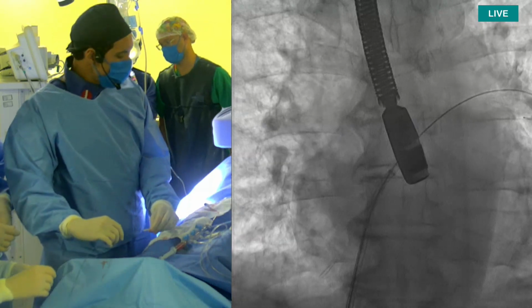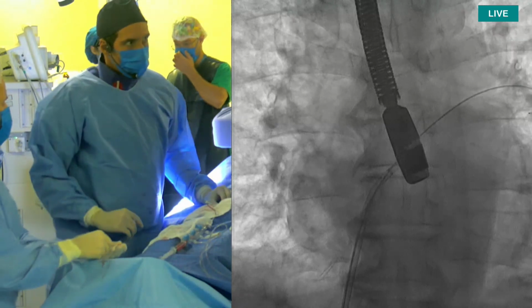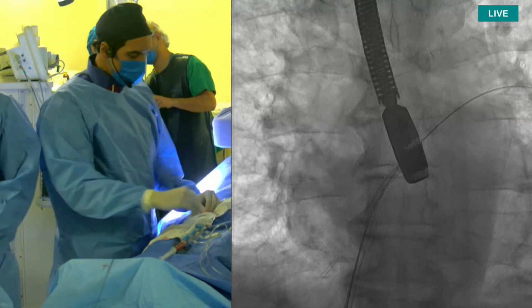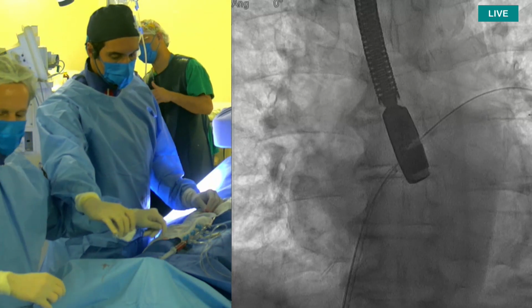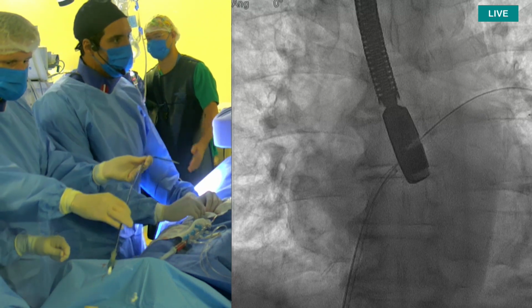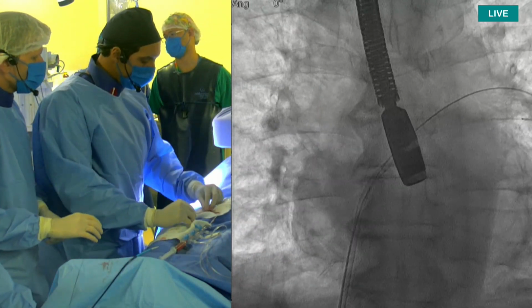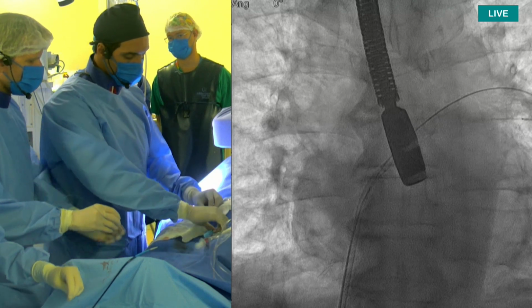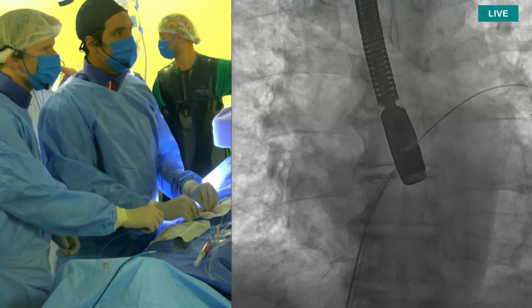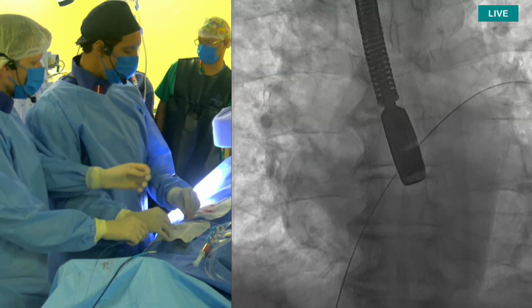Okay, so now the Amplatz stiff wire is nicely positioned in the left upper pulmonary vein. It's an Amplatz super stiff with a 1 centimeter floppy part where Fábio made a small curve, and now it's time to take out the transseptal system. I can help you with that if you want. Yeah, sure, Felipe, and then you can compress there as well. You do the first part here, and then I'll take over from here.